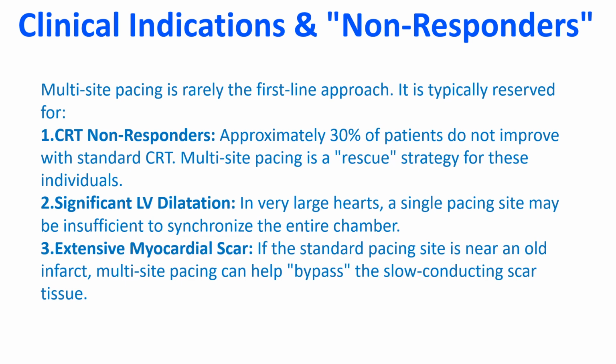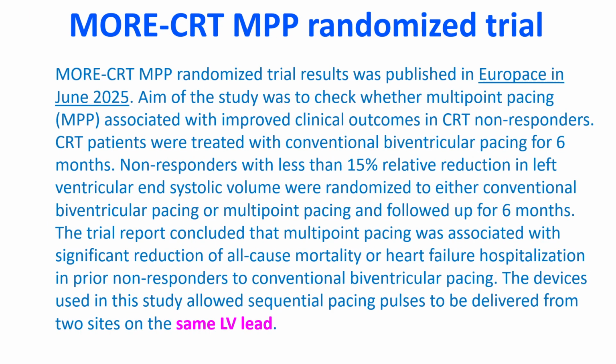Extensive myocardial scar: if the standard pacing site is near an old infarct, multi-site pacing can help bypass the slow conducting scar tissue.